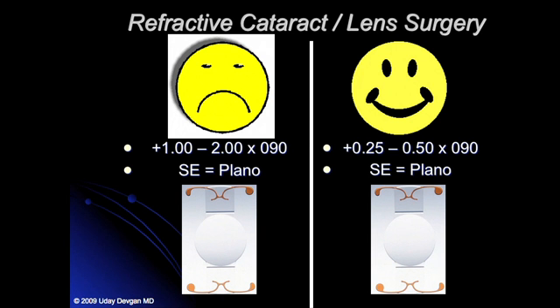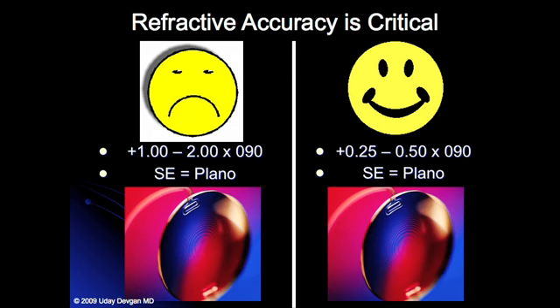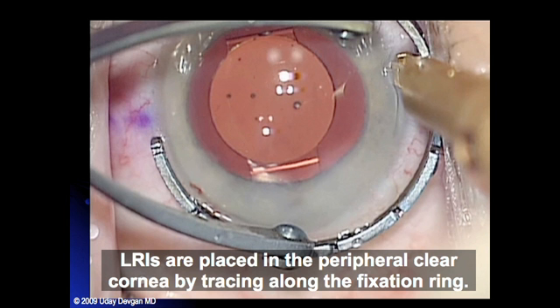The difference between an unhappy patient and a happy patient, no matter which lens you're using, is the difference between spherical, which is here, and astigmatic, which is there. Since I'm doing these LRIs, I have to be able to know the corneal depth ahead of time. So previously what I was doing was measuring every patient with a manual pachymetry measurement, because I want to do my LRIs as a percentage of corneal depth in order to have the best effects, like 90% of corneal depth.